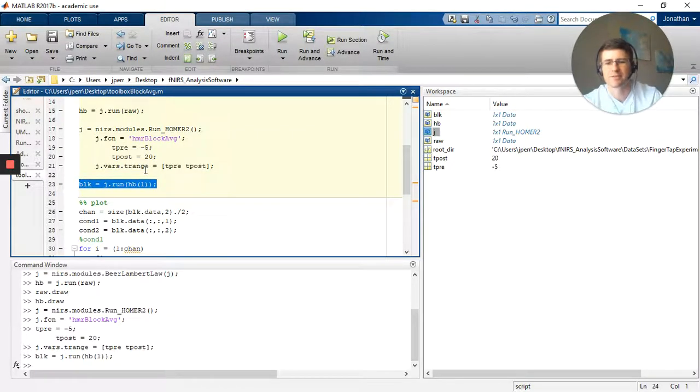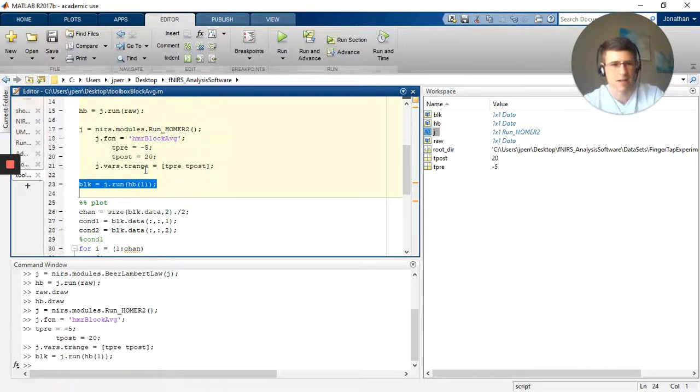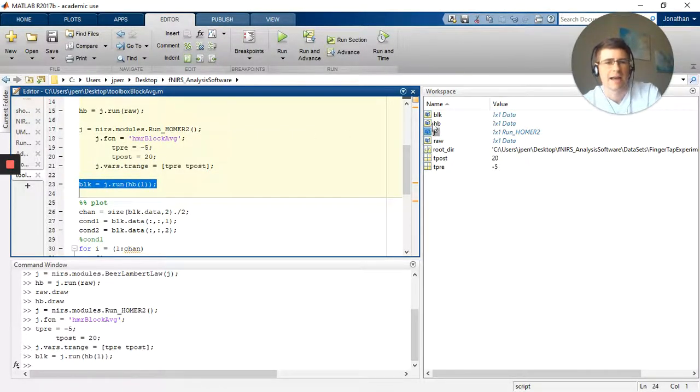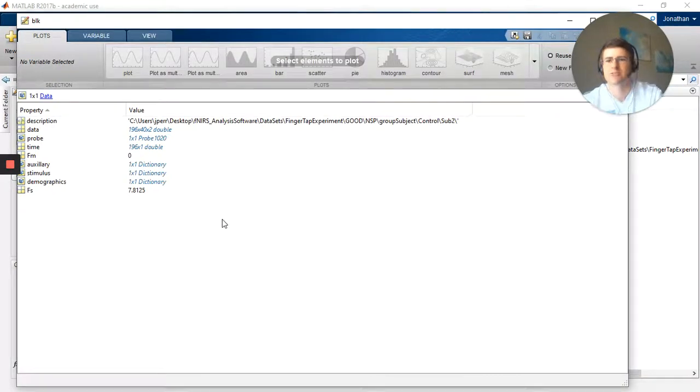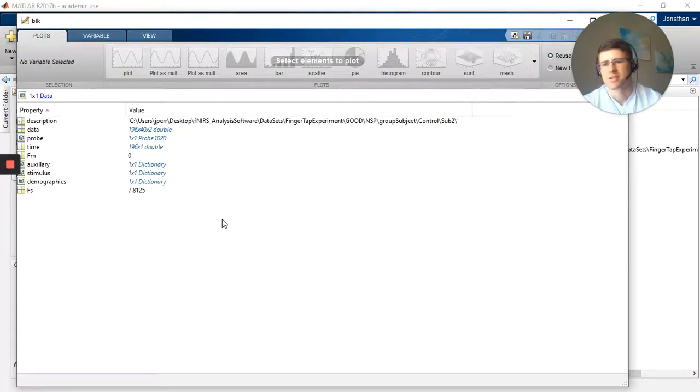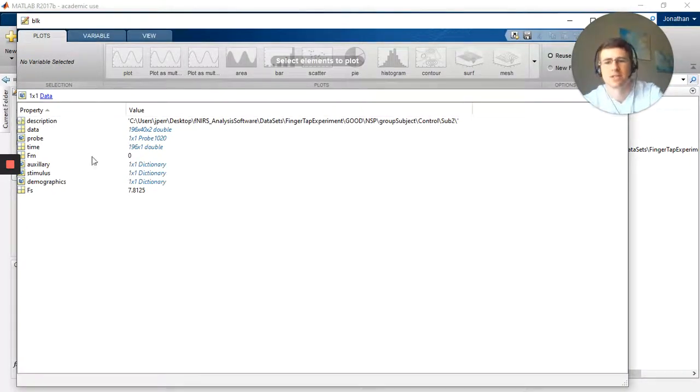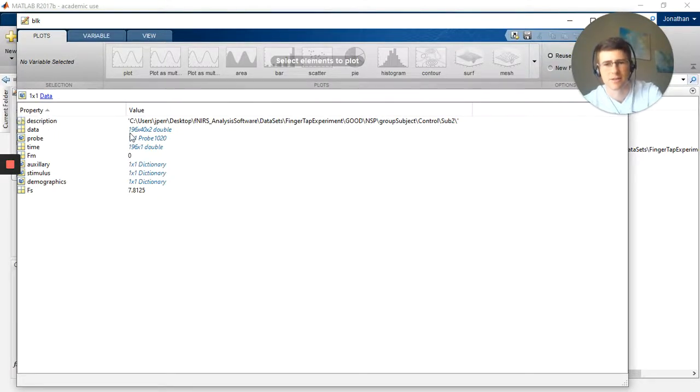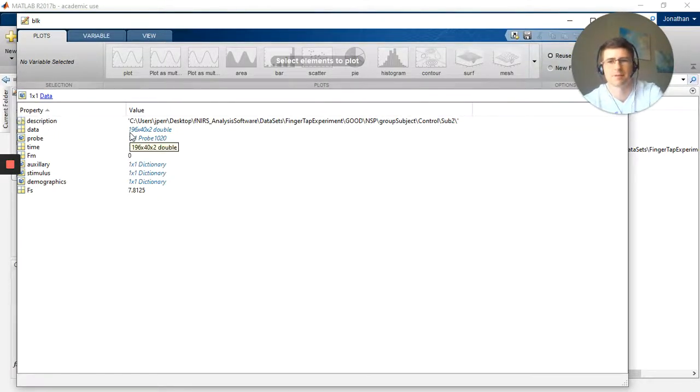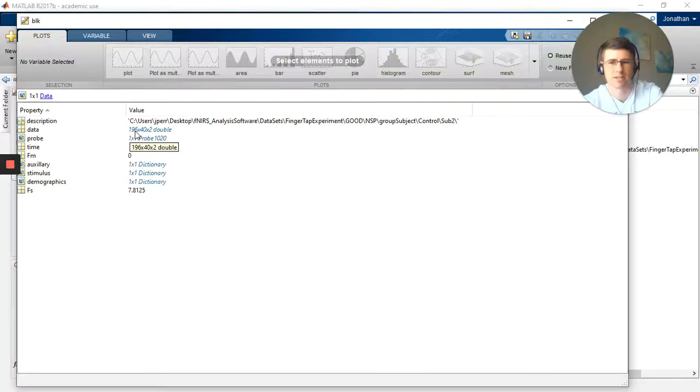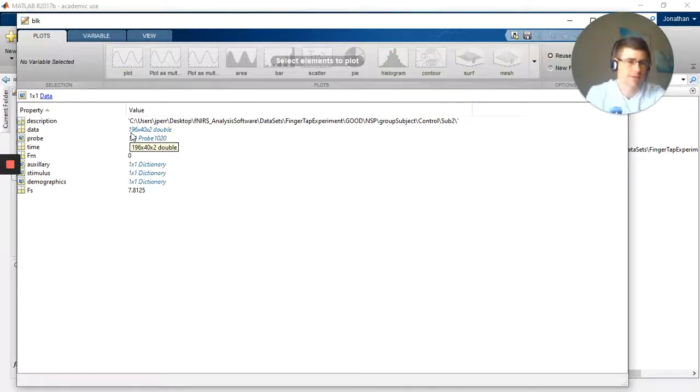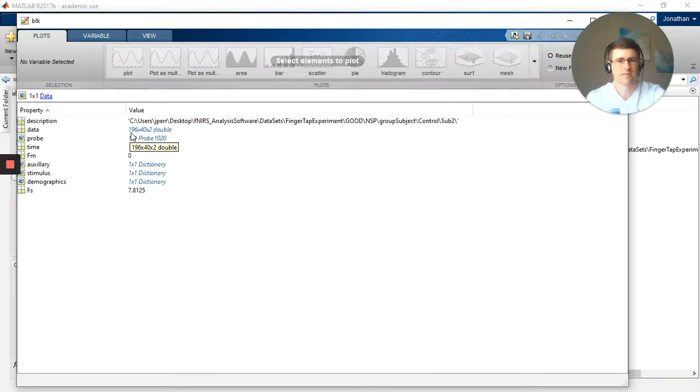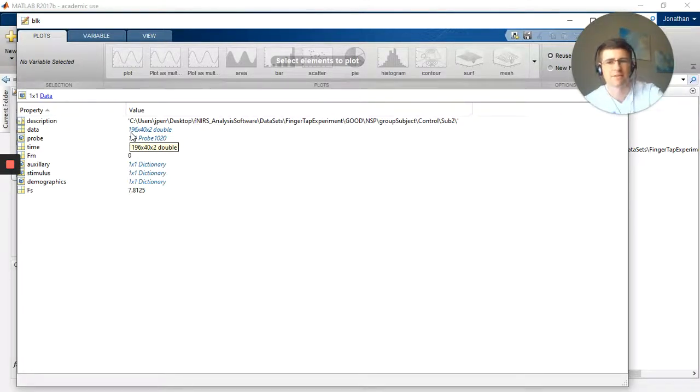I'm going to go ahead and run it, and it gives me, and I save it as blk for block. You can save it as whatever you like. And now we have our actual data, so our block average is here. So now within the data not much has changed overall, but you'll see no longer do I have 2,000 time points, but I have 196, so about 200. That's 5 plus 20, because I would have 5 seconds prior, 20 seconds after, it's 25 seconds in total, multiplied by the sampling rate.